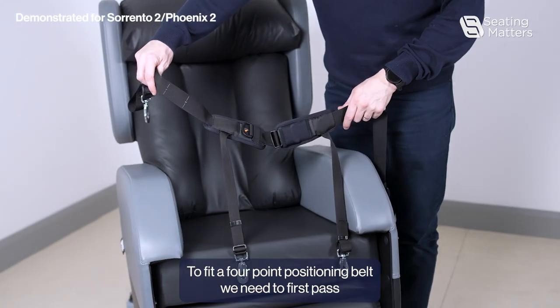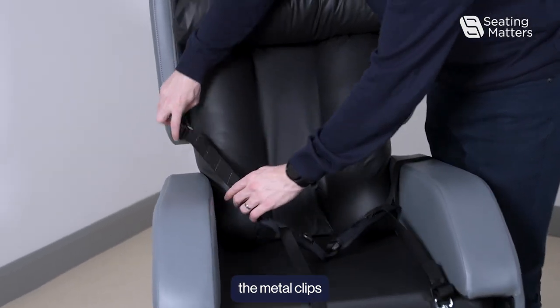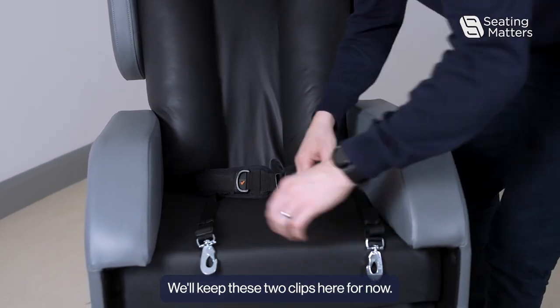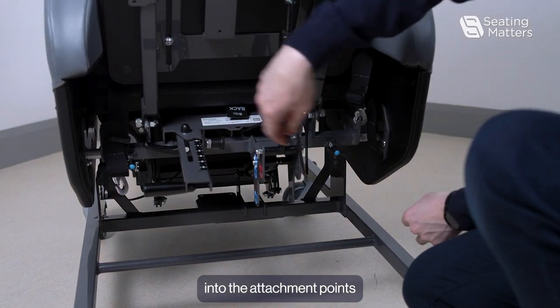This is an adjustable four-point positioning belt. To fit a four-point positioning belt, we need to first pass the metal clips down through the front of the chair. We'll keep these two clips here for now, then attach the metal clips into the attachment points.